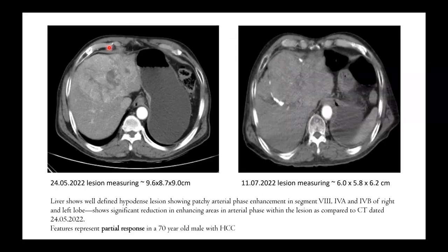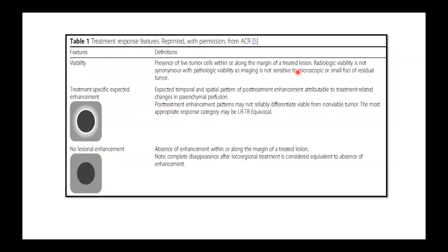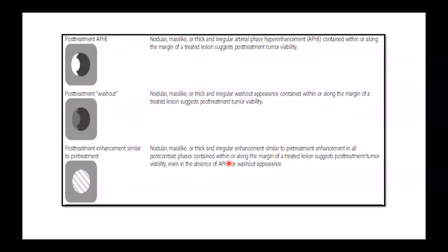Here we can see a large lesion showing arterially peripheral enhancing components with peripheral lipiodol deposition. There are different features on imaging that can help us determine whether the tumor is viable or not. No lesion enhancement — the absence of enhancement within or along the margin of the lesion — makes it non-viable. Post-treatment arterial phase hyperenhancement, post-treatment washout, or post-treatment enhancement similar to pre-treatment are all suggestive of viable tumor.